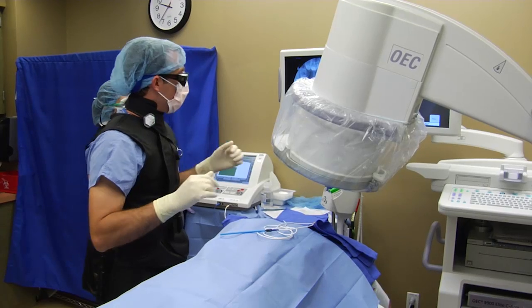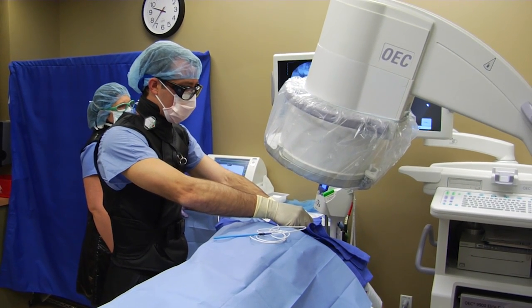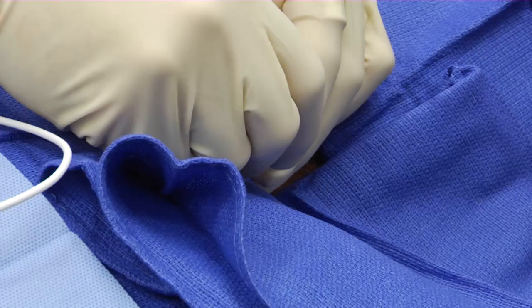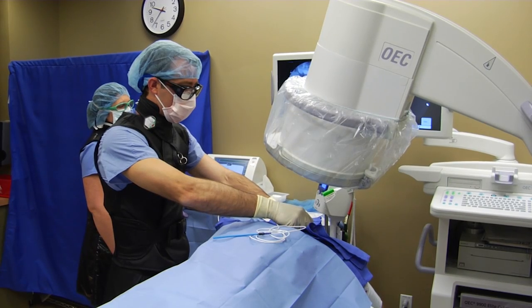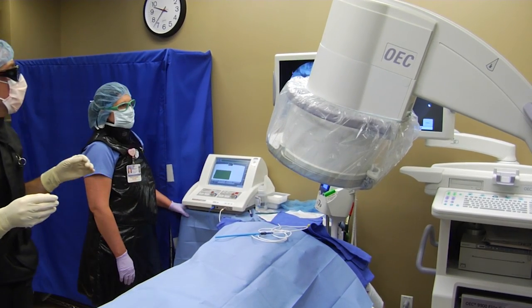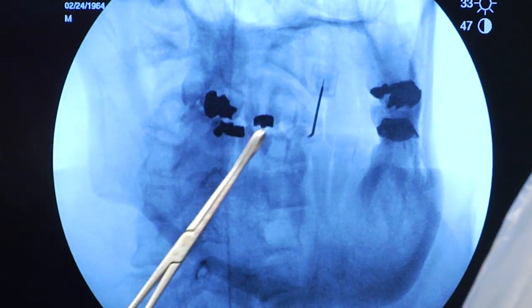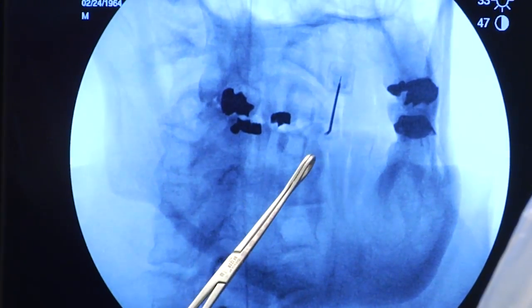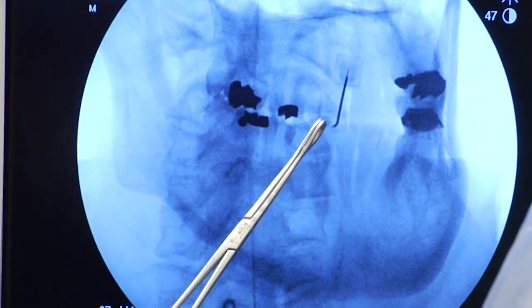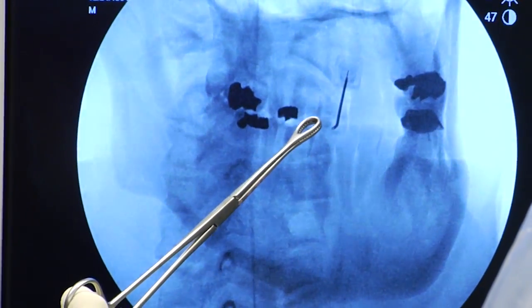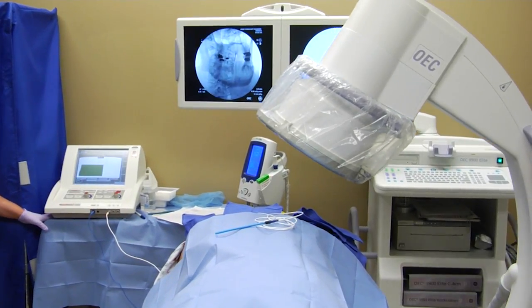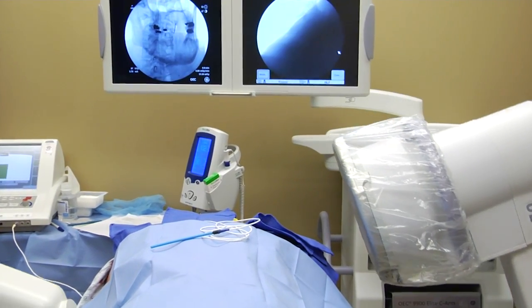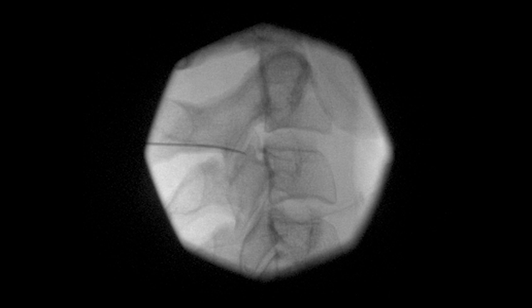Using my initial trajectory views, I position the needle tip inferior to the initial starting position. On the trajectory view, the needle tip should be positioned below the facet joint line of C2-C3 and rest on the lateral mass of C3, slightly inferior in location. On the lateral view, the needle tip should be positioned at the midpoint of the C2-C3 facet joint line and lie in plane with the most inferior aspect of the C2-C3 neuroforamen.